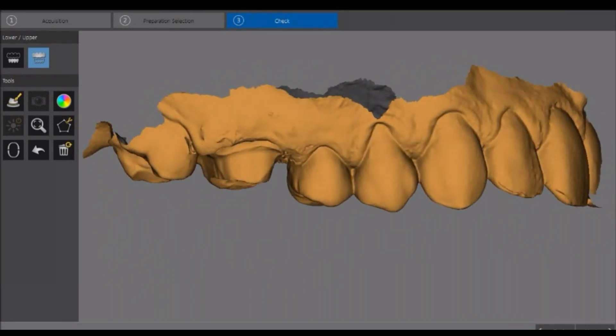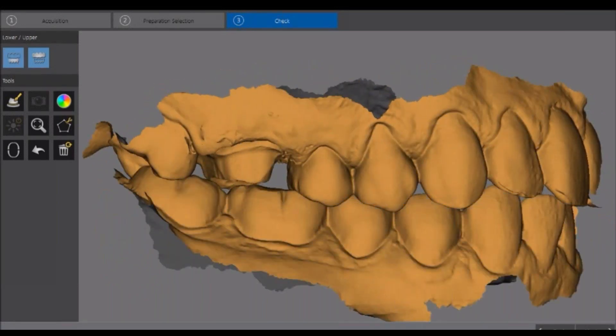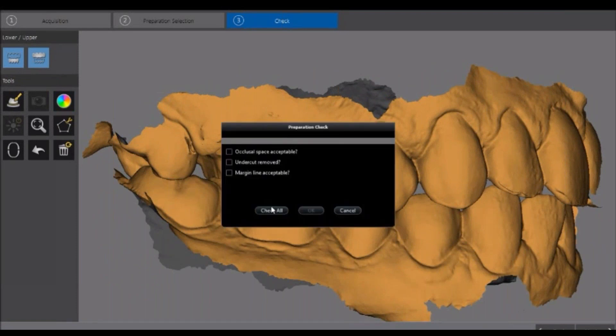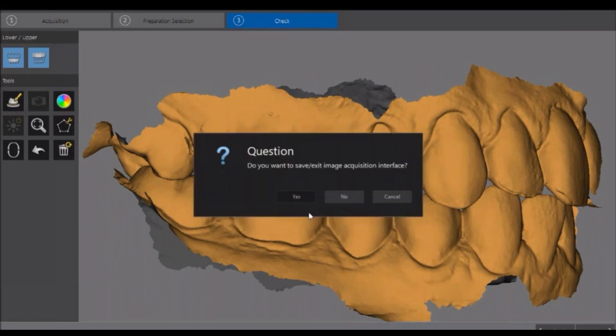We have the ability to bring in the bite and check it. Once everything's checked, we hit OK and save the images. When the patient is dismissed from the operatory, the assistant will actually send the case to the laboratory right from the operatory — writing up the prescription and sending it directly to the lab. One of the nice things about the CareStream system is there's no charge to use their lab portal.